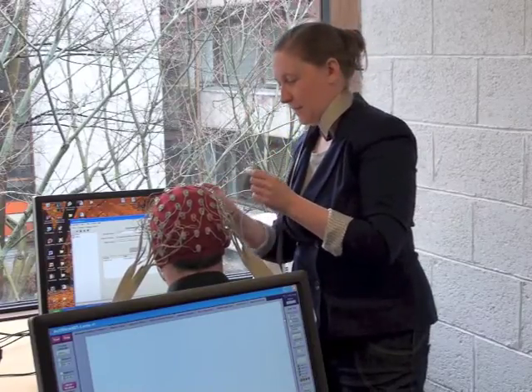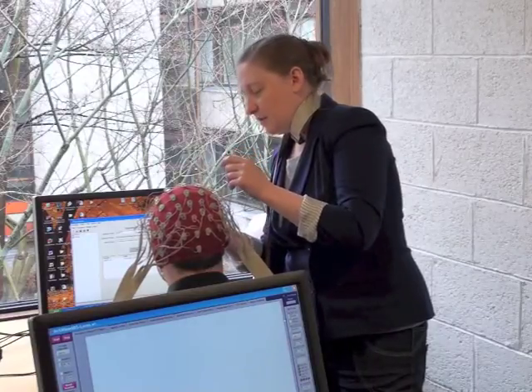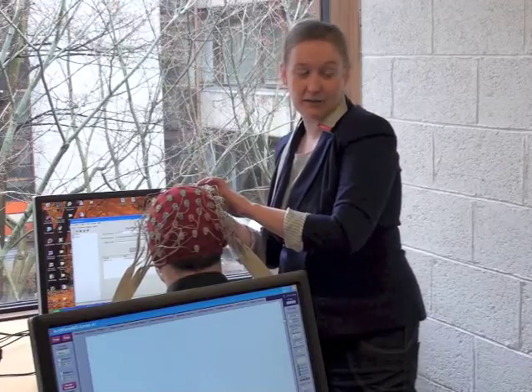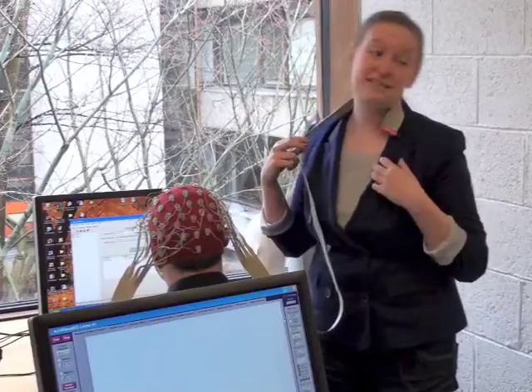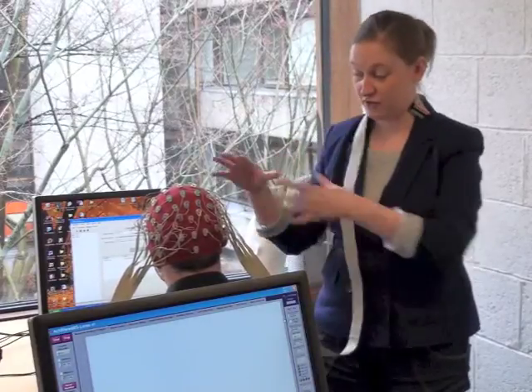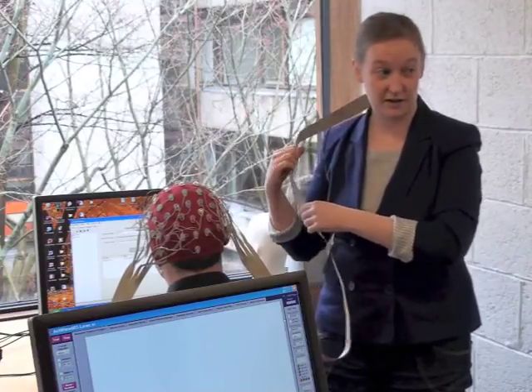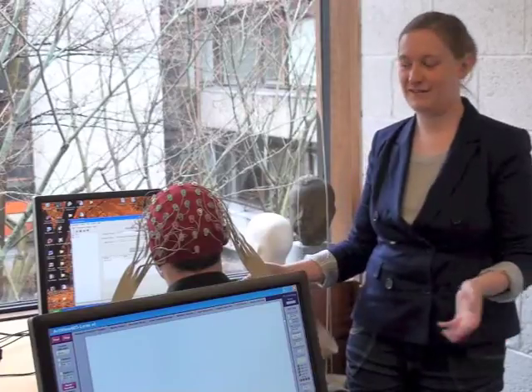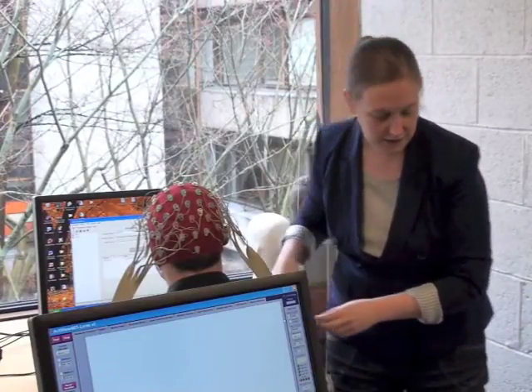And they've agreed, then you can maybe... Well, the other thing is, from now, the participant isn't allowed to move his head. Bren knows this because he's done it so many times, but if you start going like this, the electrodes are going to come away from where they're originally touching the scalp. It's not going to work. So it happens a lot. Even things like blowing your nose can really affect this type of thing. Obviously you can't deny a participant blowing their nose.